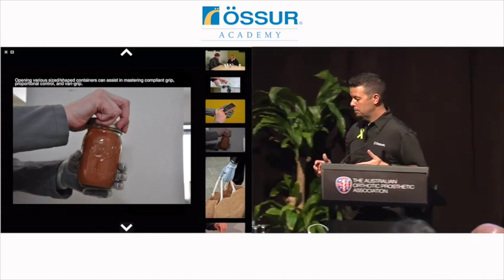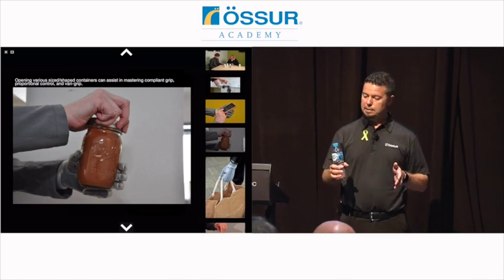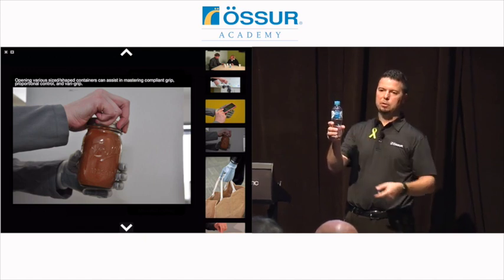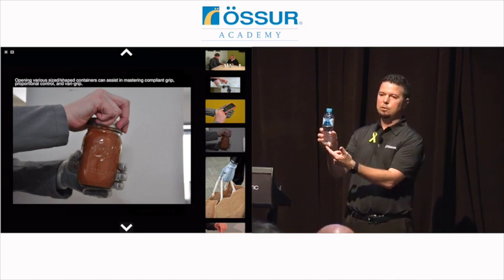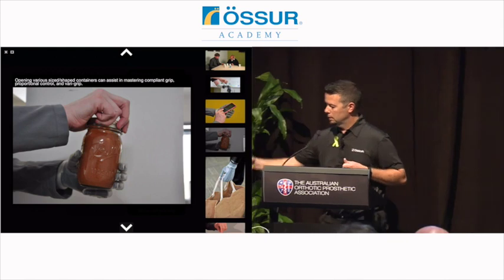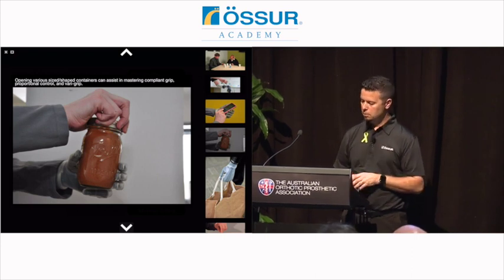A new user too, maybe they're going to a family reunion and they've got their buffet plate and they've got a drink as well. The prosthesis, they might be a little hesitant because what if I open, what if I drop it, what if I get embarrassed about that? Having that finger curl underneath their beverage of choice is a great way to instill some confidence, because even if they open slightly, they're still going to have that ledge or that platform for that pinky finger to support it. So it's a nice little thing to show them early on to hold objects like that, especially cylindrical objects like this jar, if you're opening something with force, or a can of Coke or something like that.